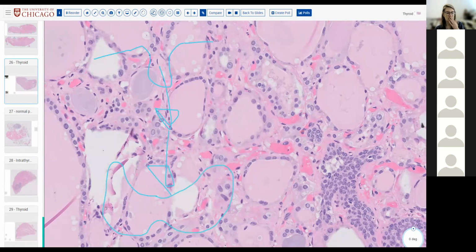All right. The C cells and the ultimobranchial body cells are now thought to both come from the pharyngeal pouch system, on bilateral sides during development. Sorry about that pouch, it got a little nasty. The pharyngeal pouch system is basically squamous type of epithelium, all right?